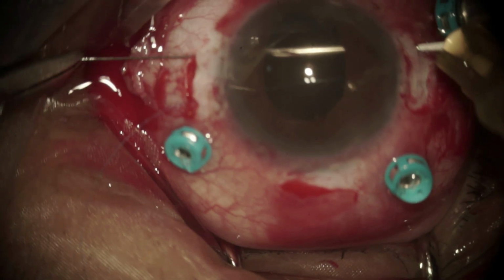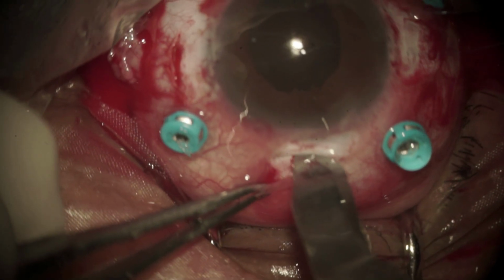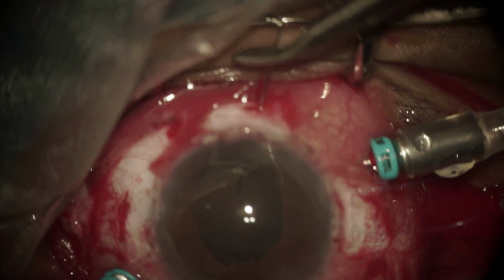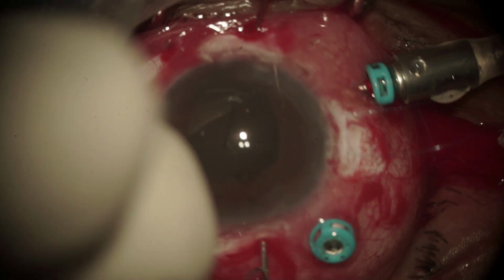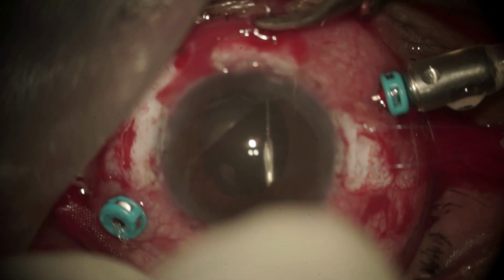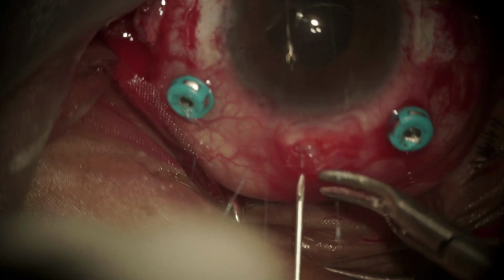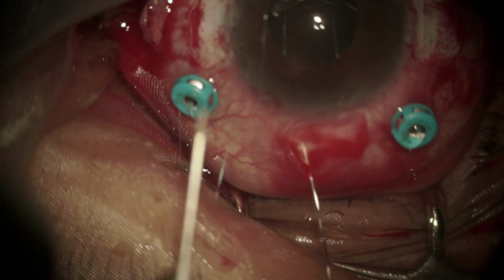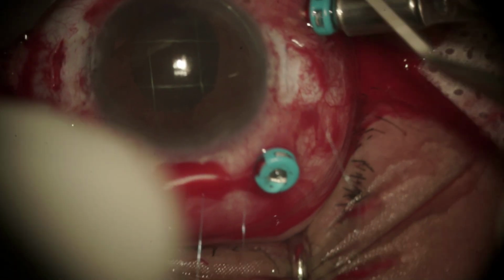The next suture is passed from 2:30 to 9:30. The same procedure is repeated vertically with sutures passed from 6:30 to 11:30 first, and the final suture is then passed from 5:30 to 12:30. The sutures are tied and the knots are buried.